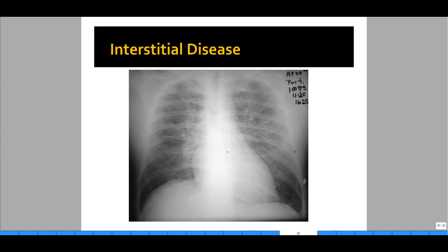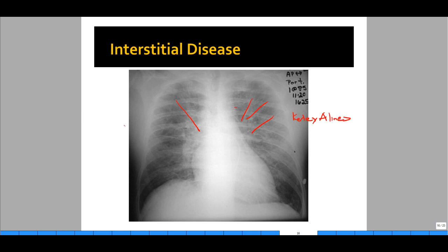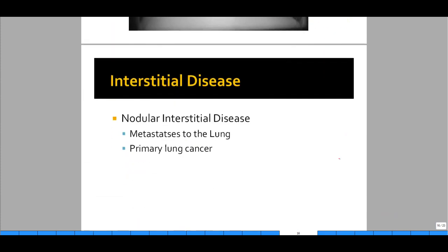In this x-ray there are some very interesting findings. We have what are called Kerley lines — Kerley lines represent the fibrosis occurring in the lungs. There are Kerley A lines and Kerley B lines. Kerley A lines are long lines that radiate out from the hilum. Kerley B lines are small peripheral lines. In this case, that is a Kerley A line present, and you'll see a few throughout the chest x-ray. Kerley B lines are very small peripheral lines that can represent interstitial disease — if you look very closely, they are very short lines toward the periphery. These are all examples of interstitial disease.